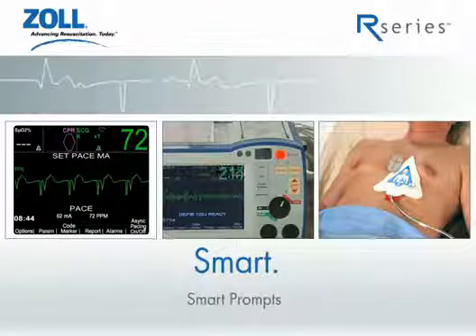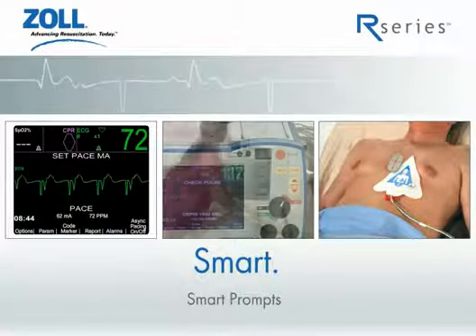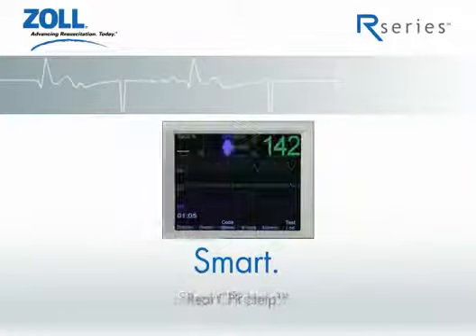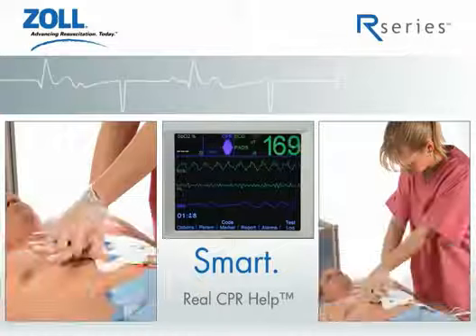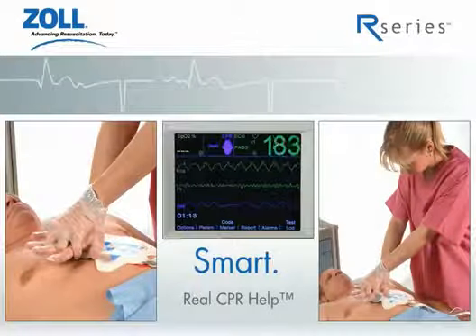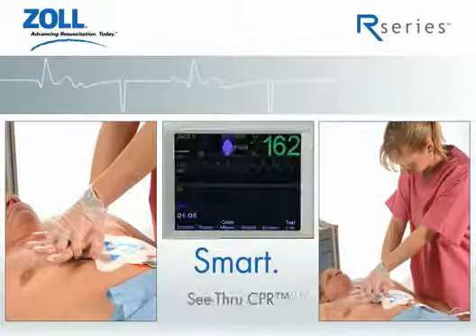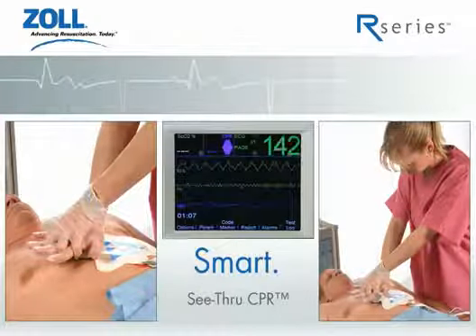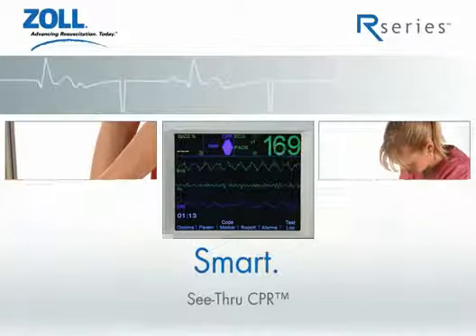Smart prompts in the R-Series coach you in the operation of the device to ensure prompt delivery of therapy to your patient. Smart continues with real CPR help, which helps clinicians deliver the best quality chest compressions by providing feedback on rate and depth of compressions in an intuitive visual display. And see-through CPR reduces interruptions by allowing clinicians to see organized electrical activity during compressions.